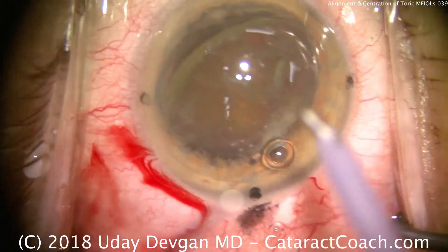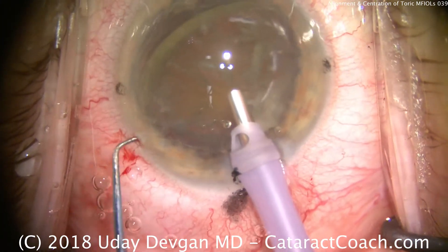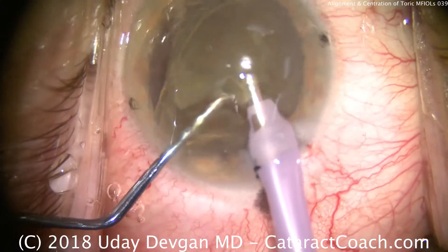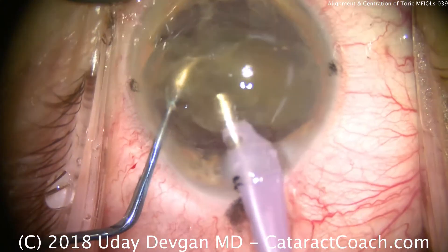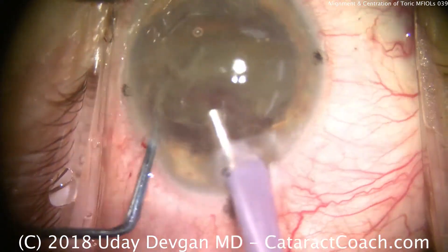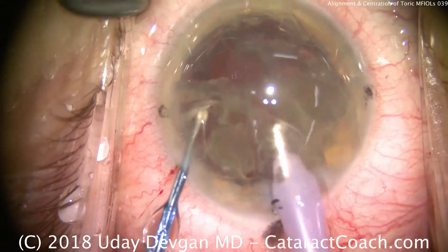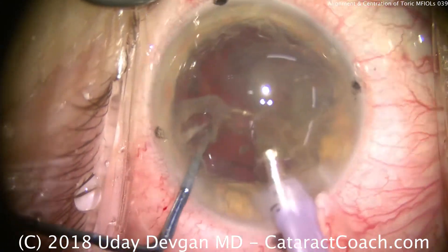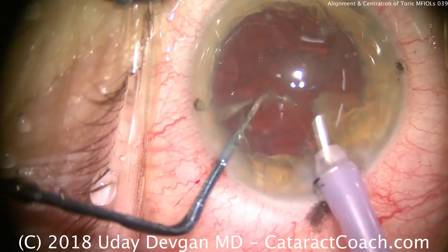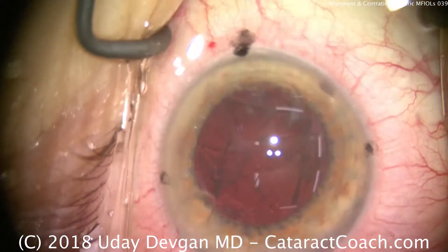Now we'll take our phaco probe — high flow, high vacuum settings, very low ultrasound energy. Put the probe inside the eye; here's the chopper. Buzz into the middle of the nucleus and we'll chop it in half. Each half can now be removed; we can further chop into quarters, or simply feed the pieces forward. The chopper's job is to keep pieces in front of the phaco probe and keep things flowing into the port. The chopper is in a safety position to prevent the posterior capsule from coming up, and we're done.